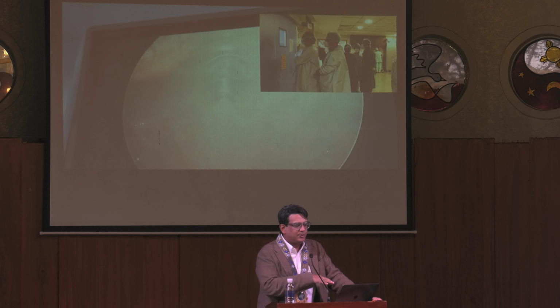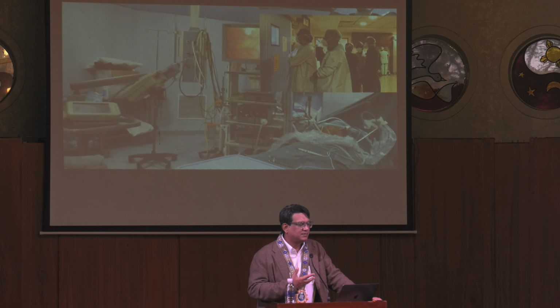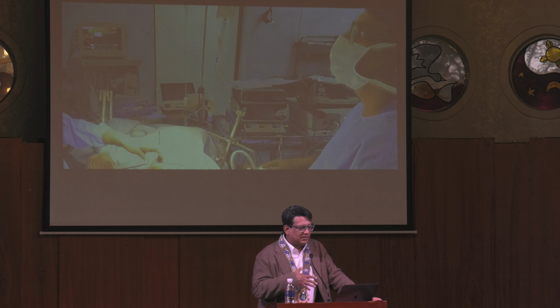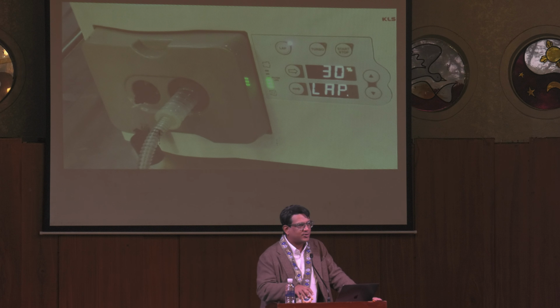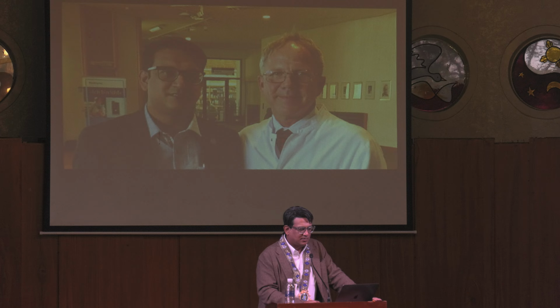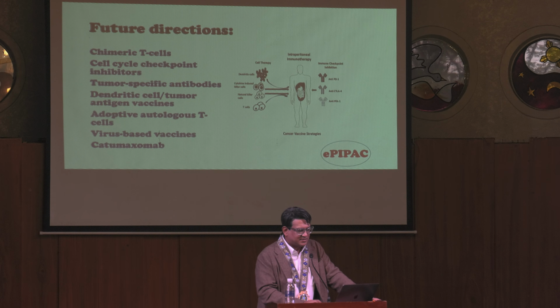Okay, so we all go outside the theater because we don't want to inhale this by mistake. So we all go outside, even the anesthetists go outside. Once we're done with that, we come back inside. We evacuate all of these fumes through a smoke evacuation system, and then close up the patient. So this was Professor Marc Reymond who invented this procedure in Germany, and we published various articles on this procedure and how it helps. There are a lot of future directions.